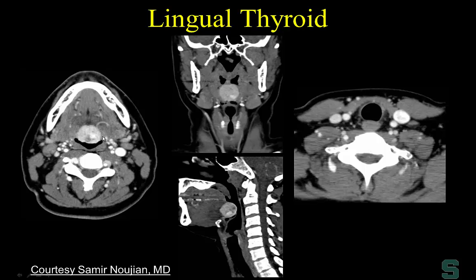Here's an example of a lingual thyroid at the level of the foramen cecum on contrast-enhanced CT — a densely enhancing mass that could be mistaken for a paraganglioma or hypervascular salivary gland tumor. The tip-off is the location right at the foramen cecum, and when you scan down to the thyroid gland level, there is no thyroid tissue present, supporting the diagnosis of lingual thyroid as a solid enhancing lesion rather than a thyroglossal duct cyst.